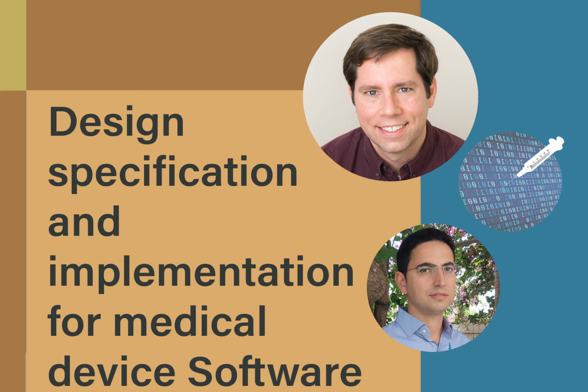I would say it depends on the complexity of the device that you're building. I tend to work, because I'm a solo consultant in my development work, on projects where it is feasible for one person to wrap their arms around a development effort. And so I typically work on devices on the lower end of the complexity scale, handheld treatment devices or diagnostic devices, patient monitors, surgical tools, that kind of thing. For the devices that I typically work on, there's just one software design document because it's typically one processor, maybe two. It's not a huge instrument with lots and lots of components.